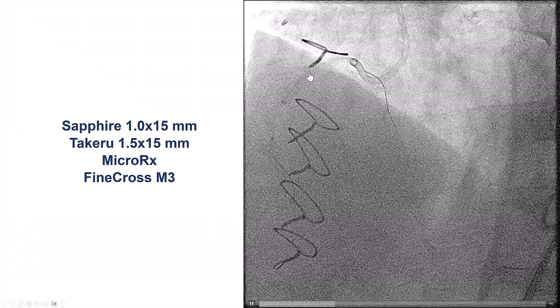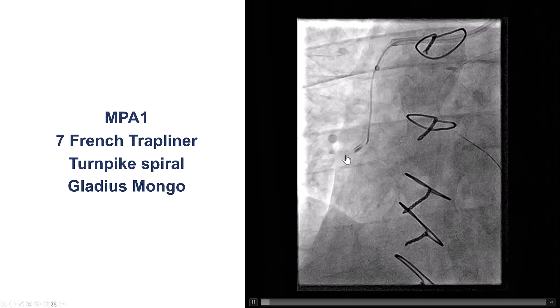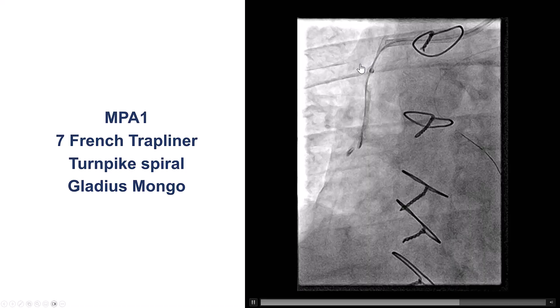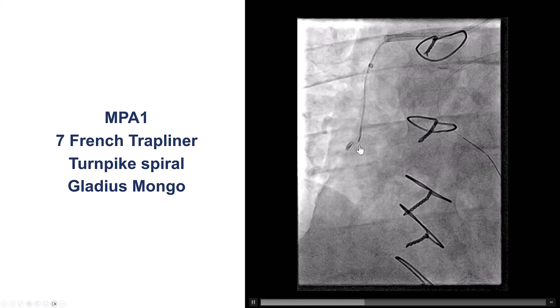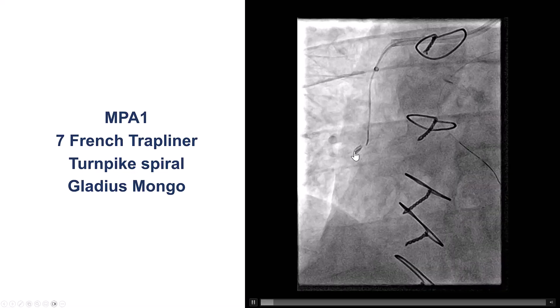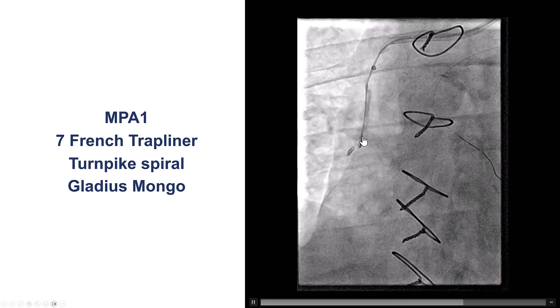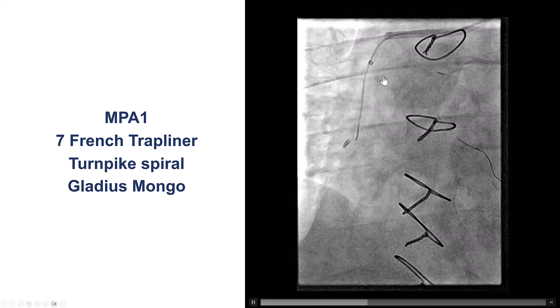After multiple attempts, we decided to change our plan and went down the saphenous vein graft using a multipurpose guide with the same guide extension. We were able to get down halfway in the graft and then could not go past that area. We tried a Gladius Mongo wire, a Gaia NX2 and Gaia NX3 — we just could not get through.